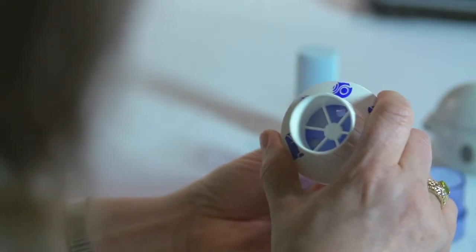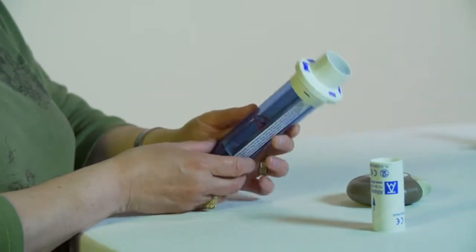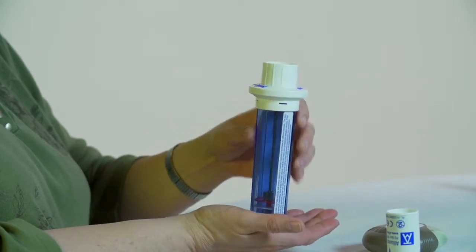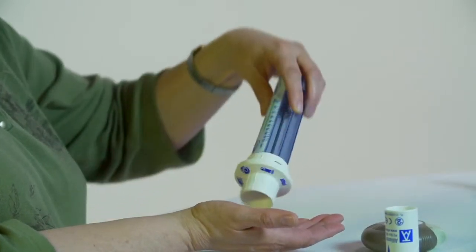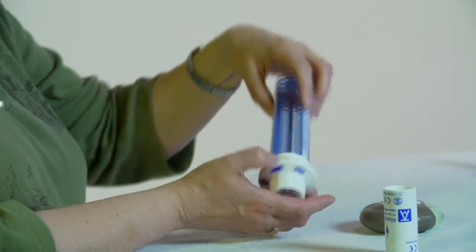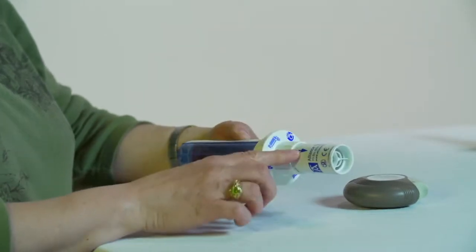I will now demonstrate how to use the InCheck Dial. For the purposes of this demonstration, I will set the dial for the Diskus. Turn the dial to the picture of the Diskus. The dial should click into place. Next, reset the device by gently tapping it on your hand until you see and hear the magnet fall. This pushes the red indicator to the bottom. Next, turn it right side up so the magnet falls toward the dial. Attach the disposable mouthpiece. Be sure that the arrow is pointing out.